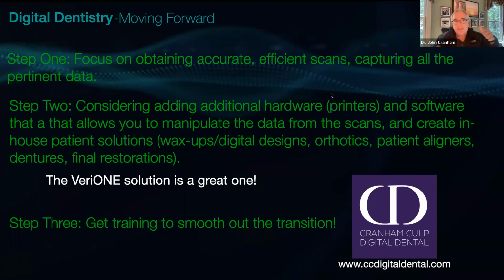because then it removes any need to open or close the vertical dimension on the articulator. What the splint software does very well is the vertical that you're at, it will just fill that space in and make both arches. And since we've been doing that, we've had unbelievably good fitting orthotics that don't require much adjustment. But it did take us a little fiddling to figure out exactly where to put the line. And that's something we certainly can share.